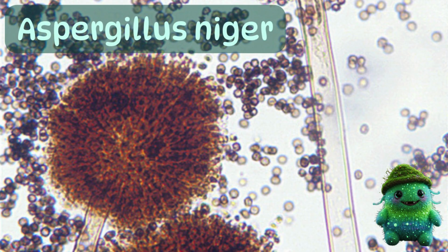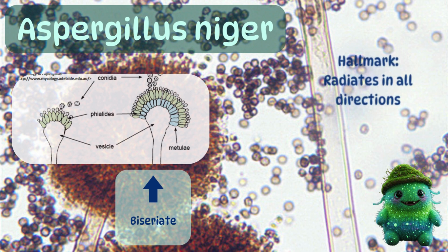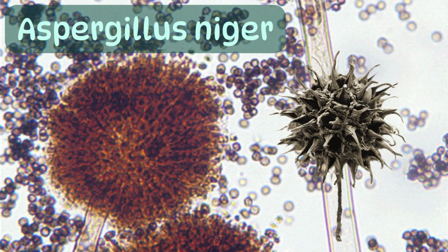For this one, the microscopic is actually pretty simple. Aspergillus niger is a giant, messy, hairy ball of phialides and conidia. It's actually biseriate, so there are 2 rows of cells, phialides and metulae, but this is hard to see. Its hallmark is the ball of phialides that radiate from the vesicle in all directions. Kind of looks like the fruit from a sweet gum tree.